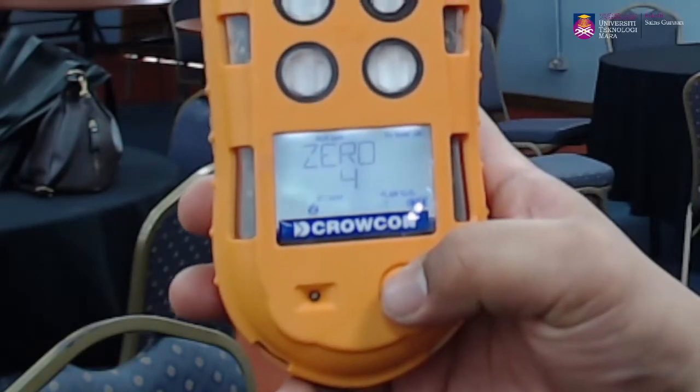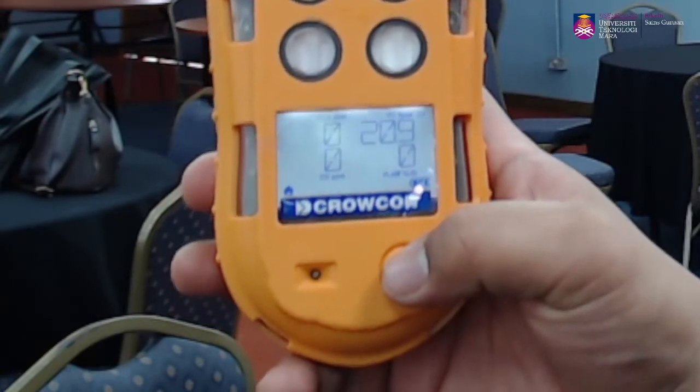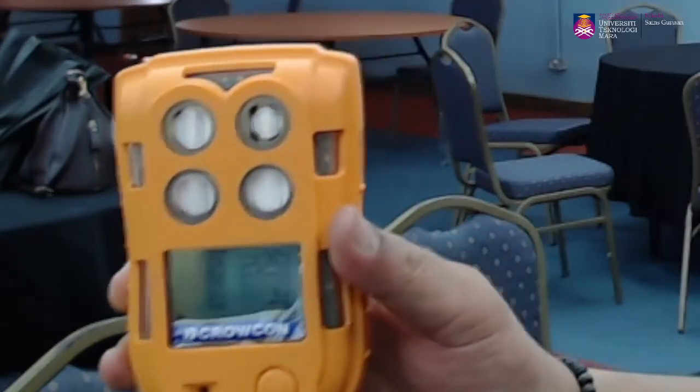And then it will provide automatic zeroing for 5 seconds. No need to press anything. When we turn it on, it will go through the process by itself.